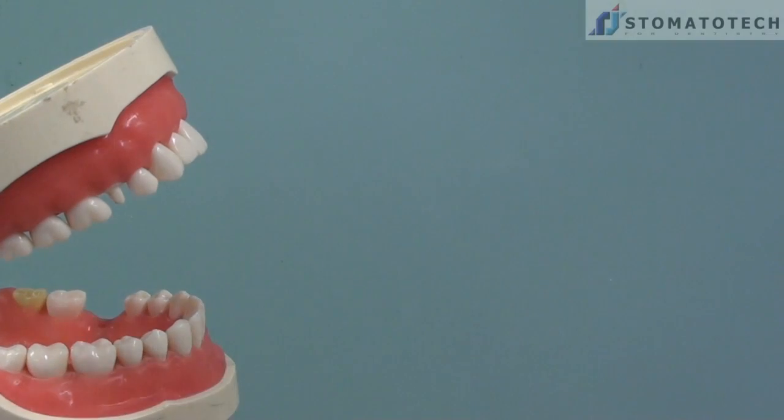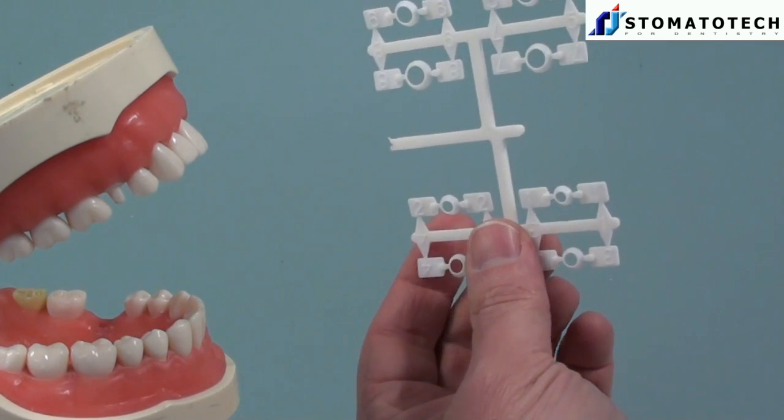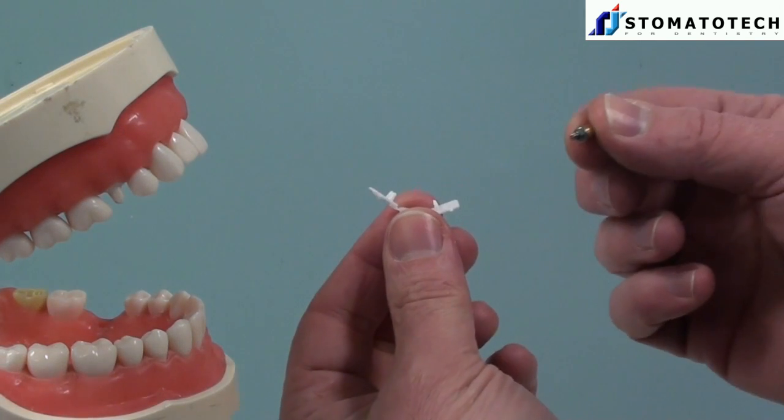This is another video from Stomatotech. I am going to demonstrate the new G-Cuff and how you can use the G-Cuff to carry the abutment into the patient's mouth. So we get the G-Cuff in that form. We take for our purpose number 5.